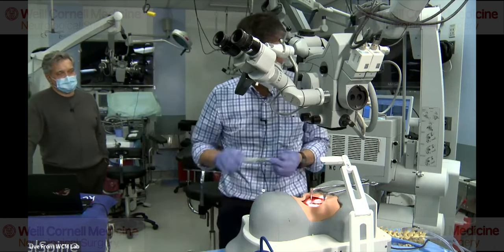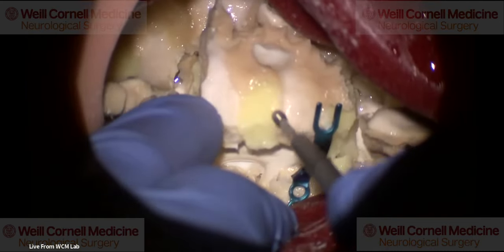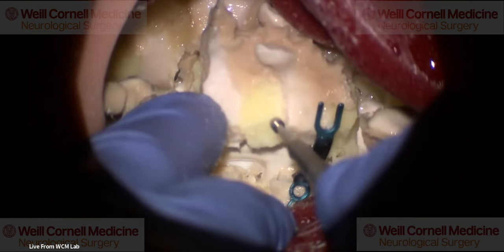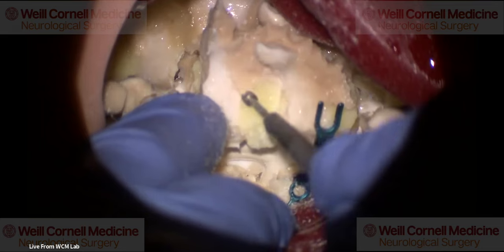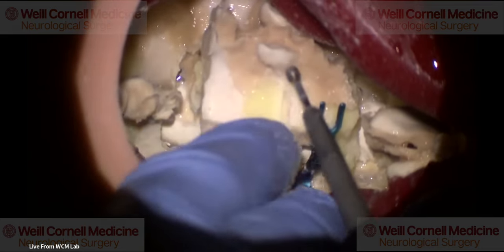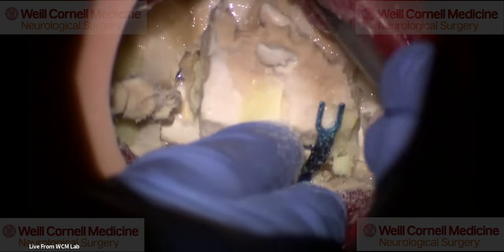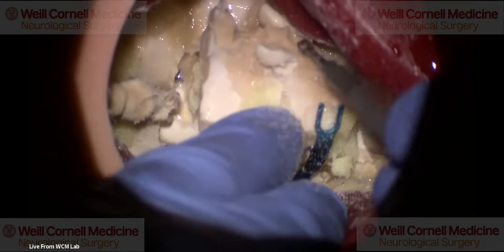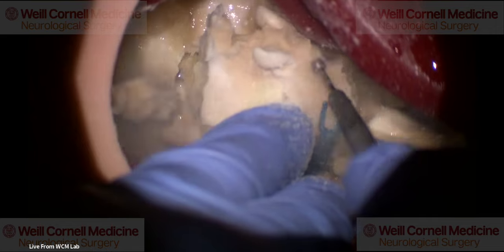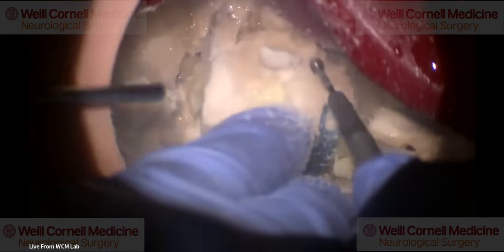So in a case like this, after I've stabilized it, this is going to be kind of brittle, but I would remove enough of the lamina here so that it doesn't hit this one. And then the final thing is I remove the spinous process here. I'm going to remove it on this one since I have the plate. Otherwise, that spinous process will impinge on the muscle and will rub back and forth. So by removing it, it presents a nice smooth trapezoidal surface to the dorsal muscles, and it'll be much, much better.